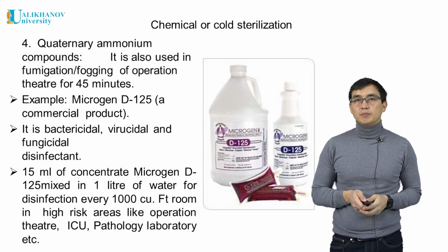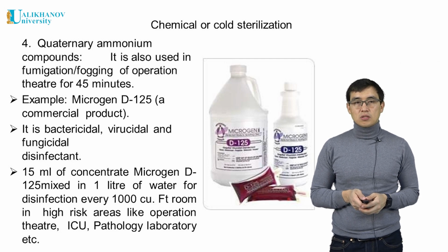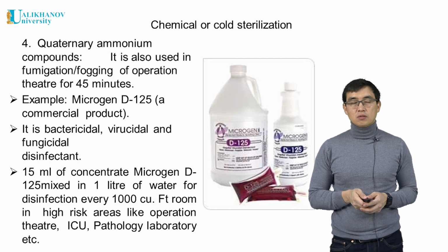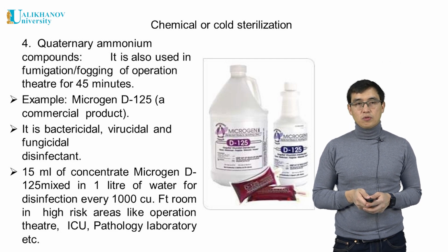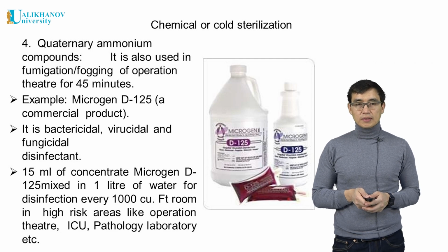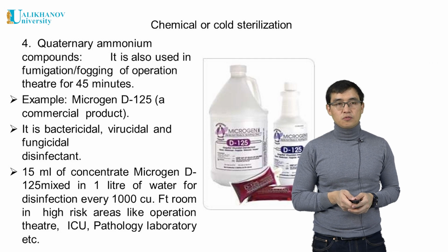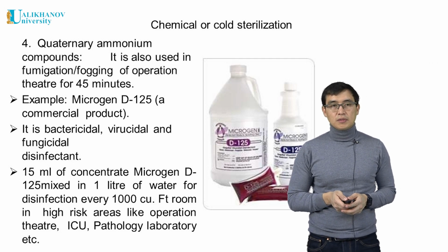Quaternary ammonium compounds are also used in fumigation, fogging of the operation theater for 45 minutes. For example, Microgen D125. It is a bactericidal, virucidal, and fungicidal disinfectant.